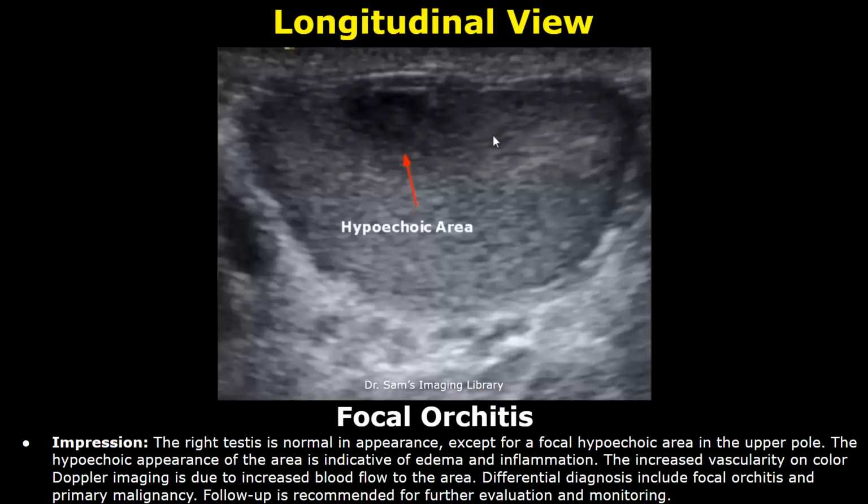In the impression you can write the main features, and after that you can write differential diagnoses include focal orchitis and primary malignancy. Follow-up is recommended for further evaluation and monitoring.